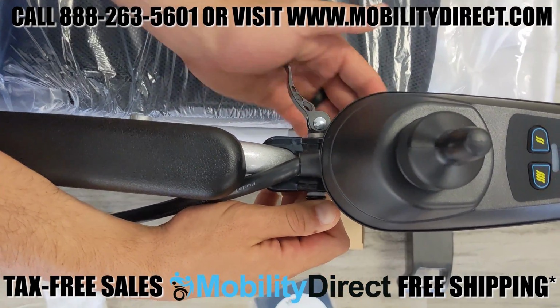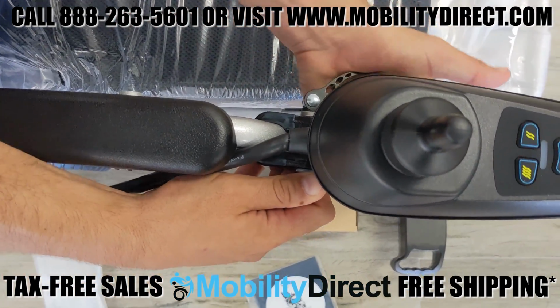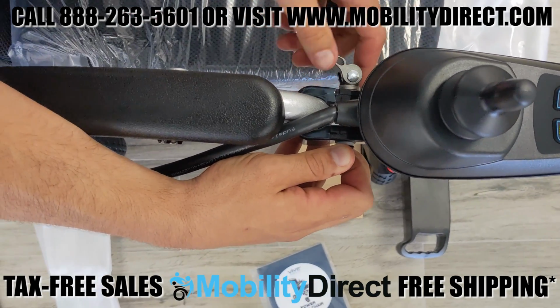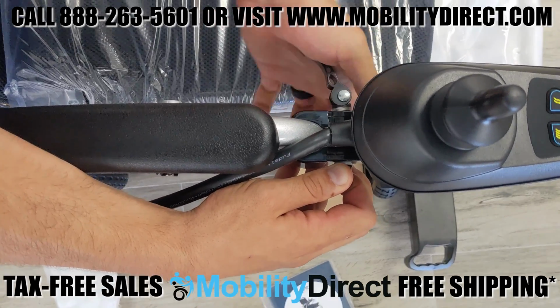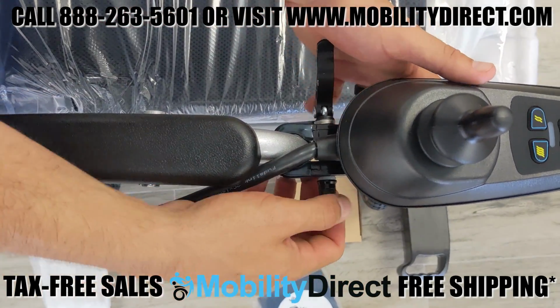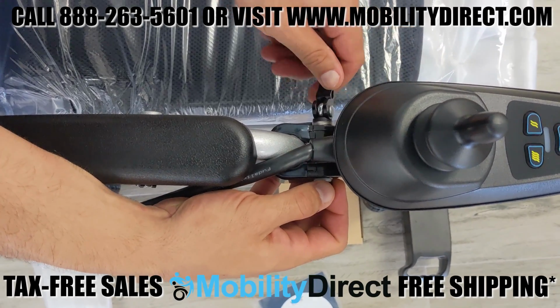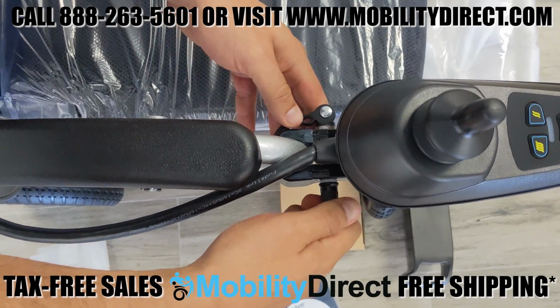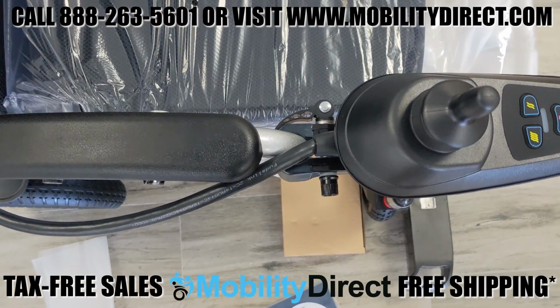Keep in mind that if you tighten it too much, it'll actually spring load it and it'll not allow it to close. As you can see here, we're trying to close it and it's just too tight and it's popping right back out. So if that happens, just make sure you loosen it a little bit. And what you can actually do is close it and then tighten the nut on the right side like we're doing here. That's probably the best bet to keep it secure.